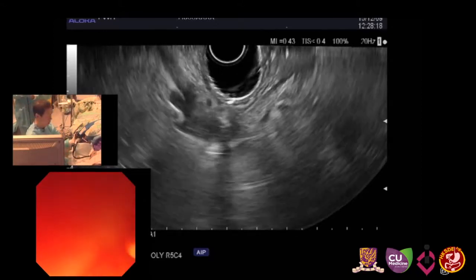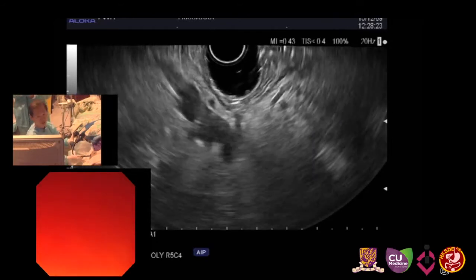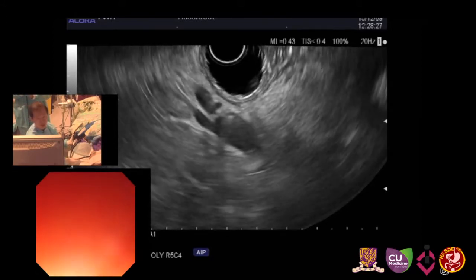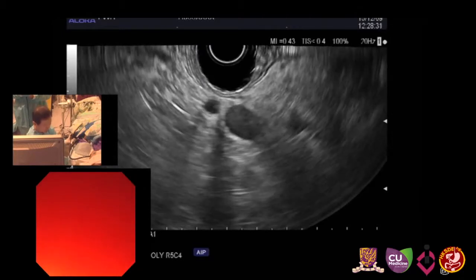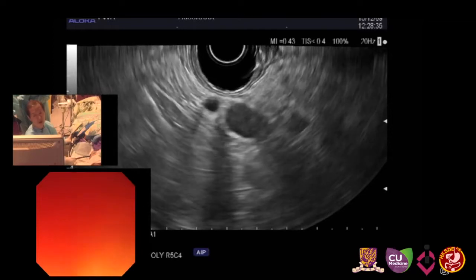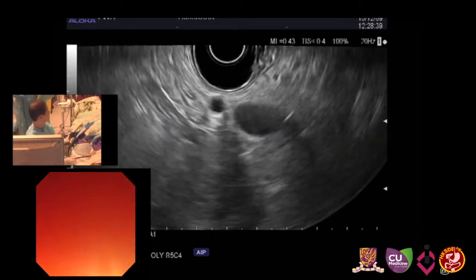Generally, with a left lateral position, the duodenum catches a lot of air, so we need to apply suction and also balloon. And this is a linear scope. Some people think that with linear, balloon is not necessary, but my thought is different. Even though it is linear, balloon frequently is very useful.